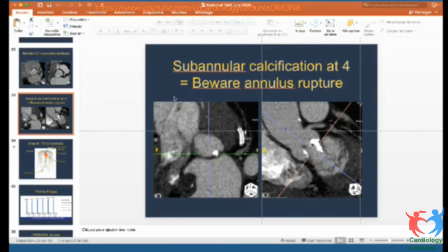In our setting, we do get a lot of rheumatic valvular heart disease patients, some of whom have previously had a mitral prosthesis. In such settings, I would probably prefer a balloon expandable valve because you could have problems using a self-expanding valve.